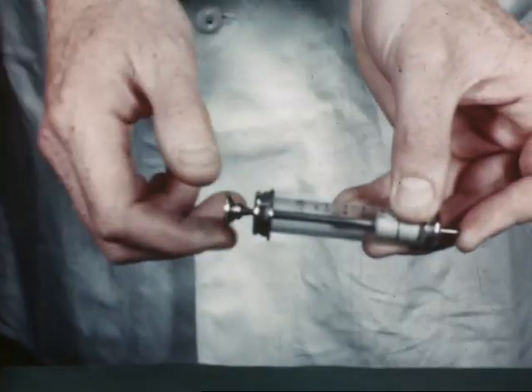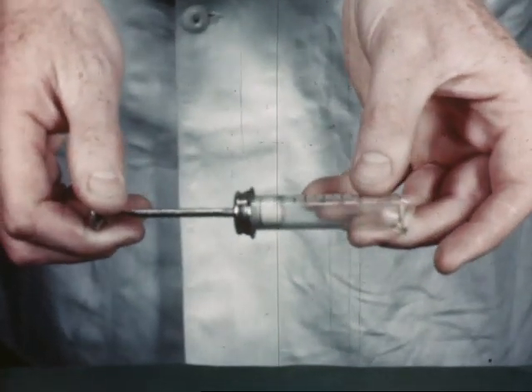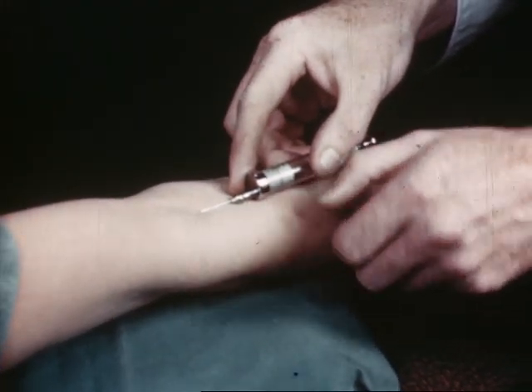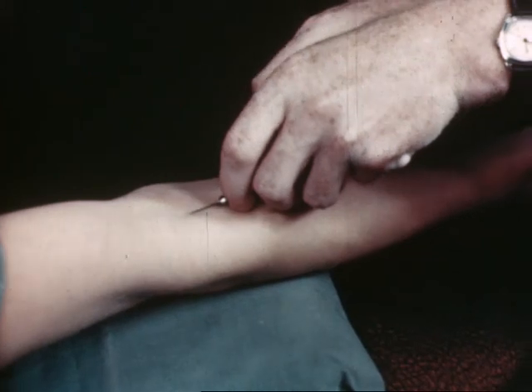This is how not to do it. Yet another fault which may result in laceration of the vein and a haematoma is changing hands like this.